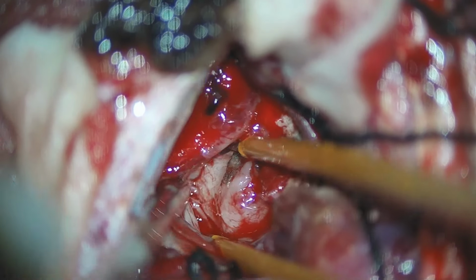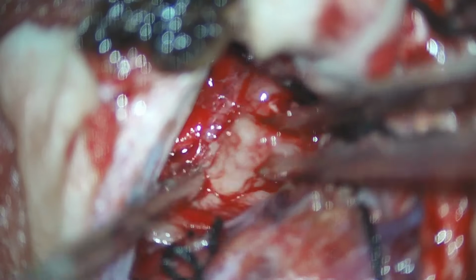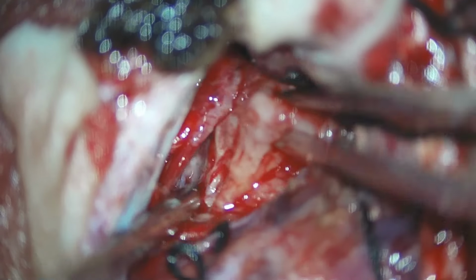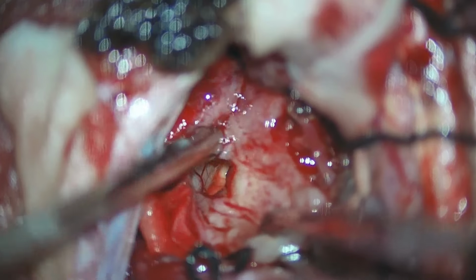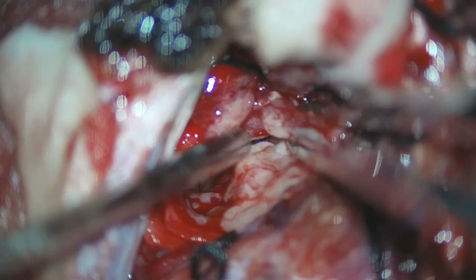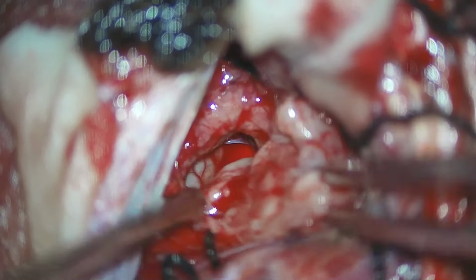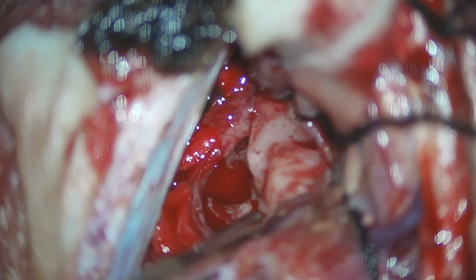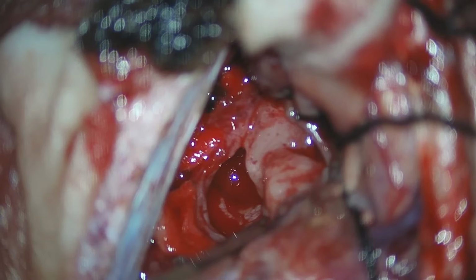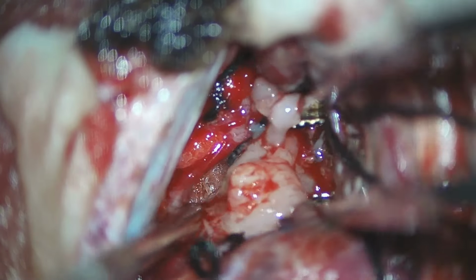We have to identify the tumor tissue from the normal brain by color, feel, and sometimes through suction, the strength of suction also. We are going into the medial aspect where we can see the ACAs, anterior cerebral arteries, that have been pushed earlier by the tumor to the opposite side, have come back into the normal place. Now we slowly debulk the part of the tumor that is in the medial aspect, and we follow the tumor to the origin that is from the corpus callosum.